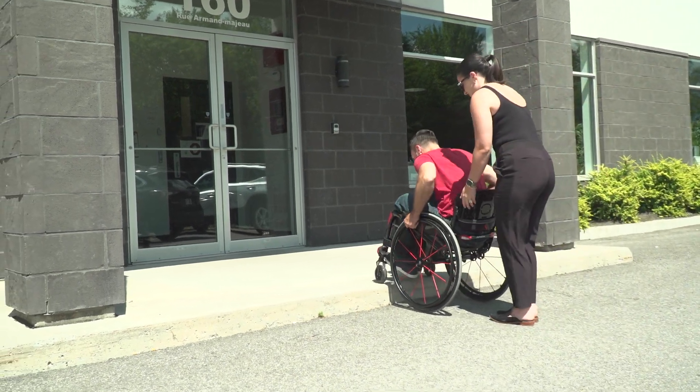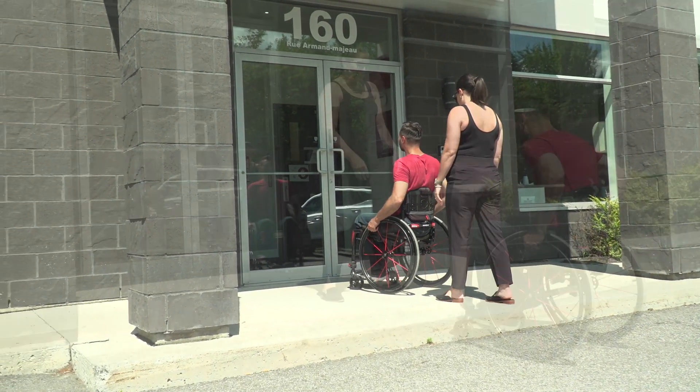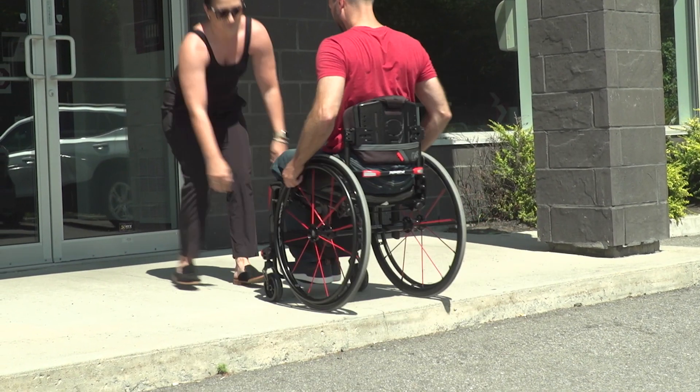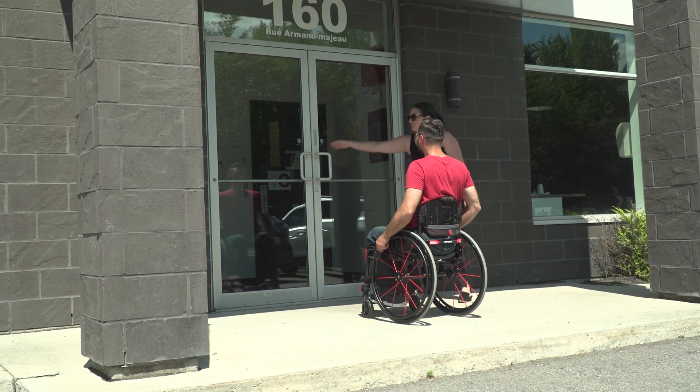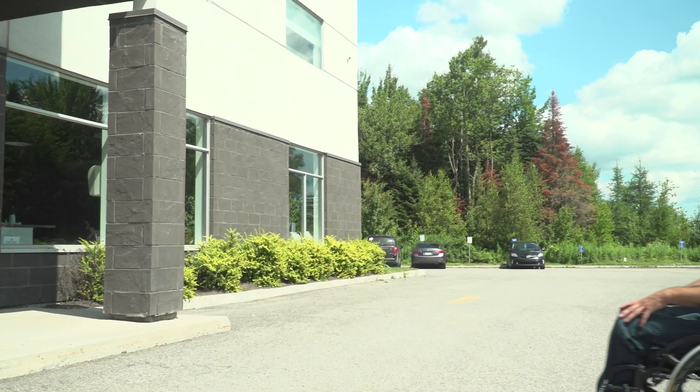Today we're going to talk about going up and down a curb. First, in a wheelchair without push handles, the client first does a wheelie to get their casters up onto the curb before you assist. You can assist from the back, or you can assist from the front pulling up on the front frame of the wheelchair.